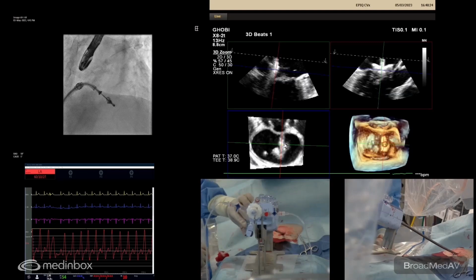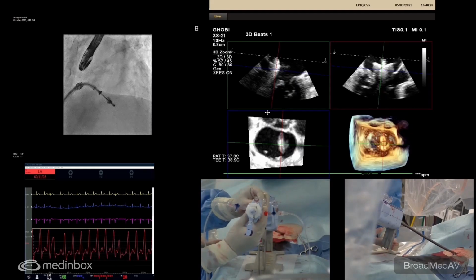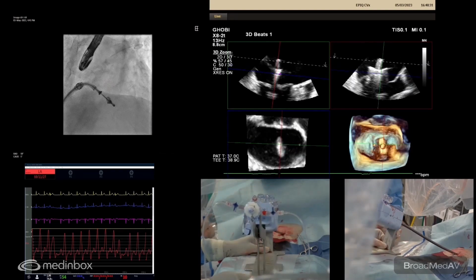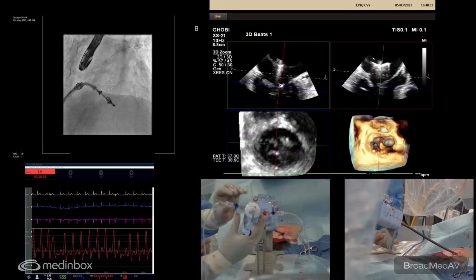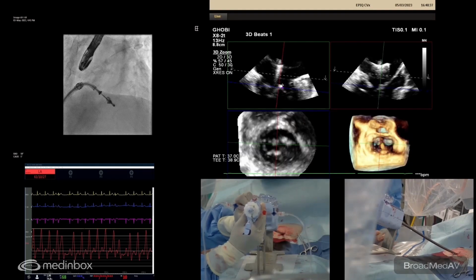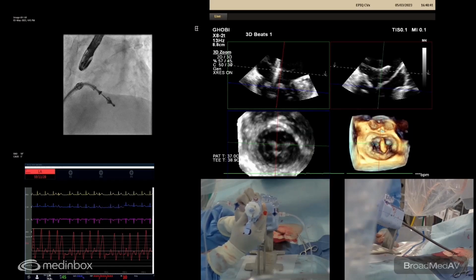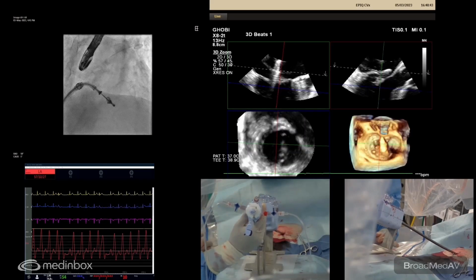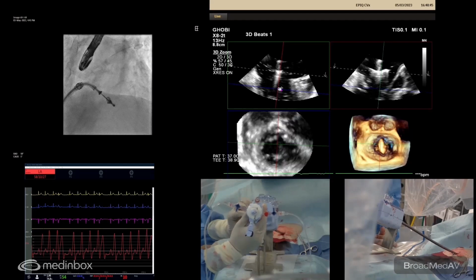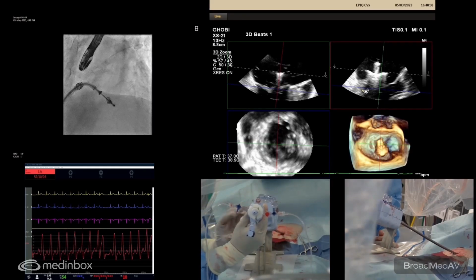You see that? Yep. And I want to take a little bit of M off, right? And you're going to want to move more laterally as well, right? Yes. Let's go a little bit more middle. I want to end up with no medial jet. You're right. How about that? Or should I take a little bit more M off? Just a tiny amount.